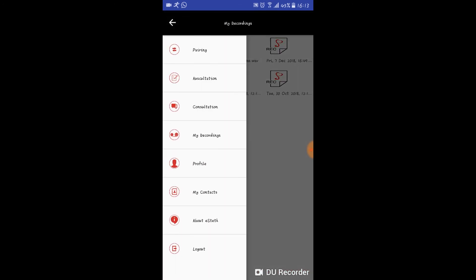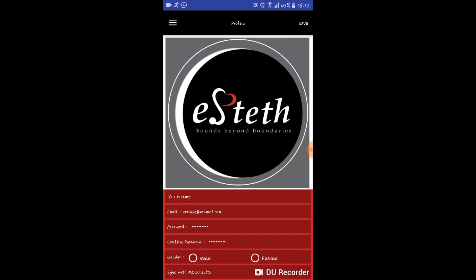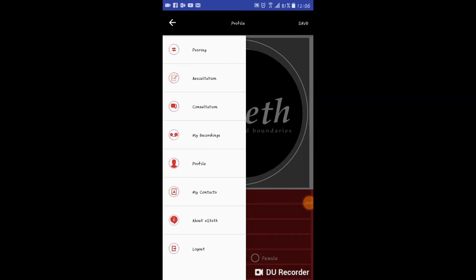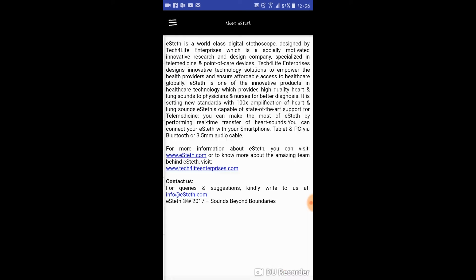The profile option allows you to edit information and add different profile pictures as well. You can learn more about e-steth if you go to the about e-steth option.